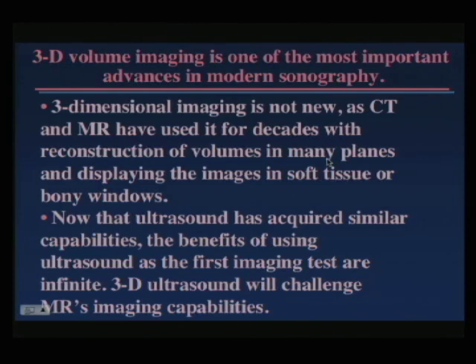You know, 3D imaging is not new. CT and MR have used it for decades with the reconstruction of volumes in many fancy displays in any plane, using soft tissue windows, bony windows, lots of different types of displays and windows. In fact, now ultrasound has acquired a similar capability. That's why 3D volume imaging in ultrasound is one of the most important advances in modern sonography.